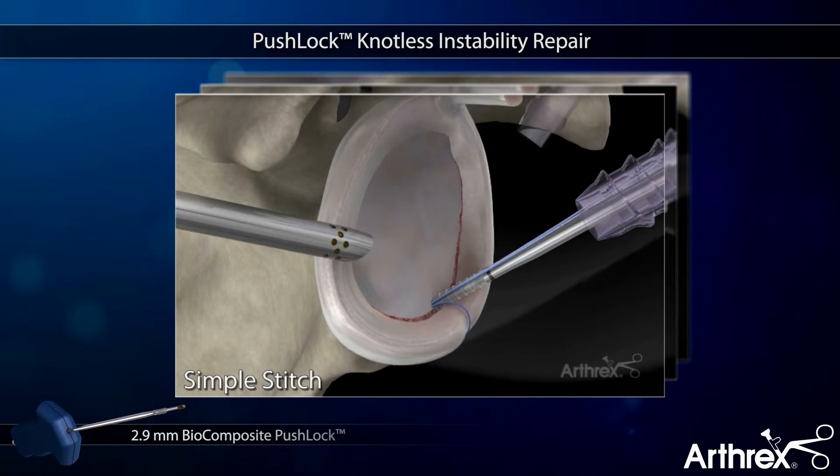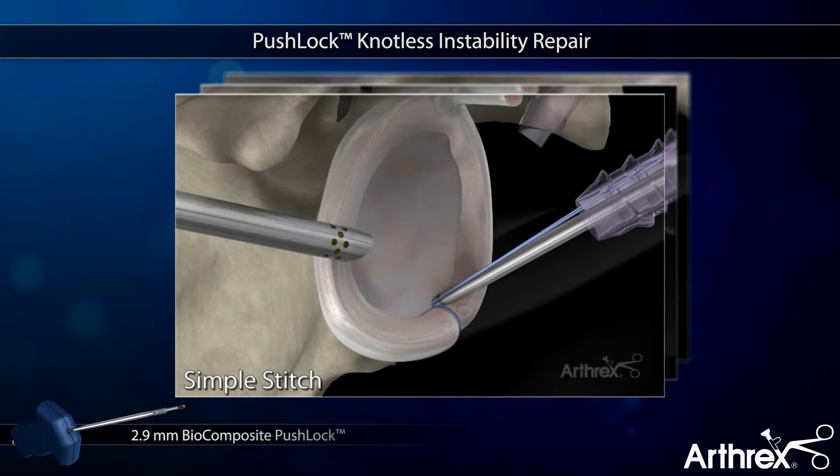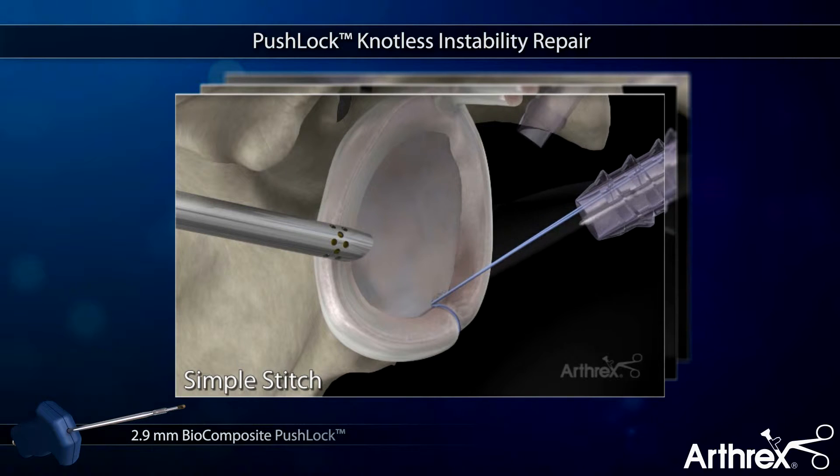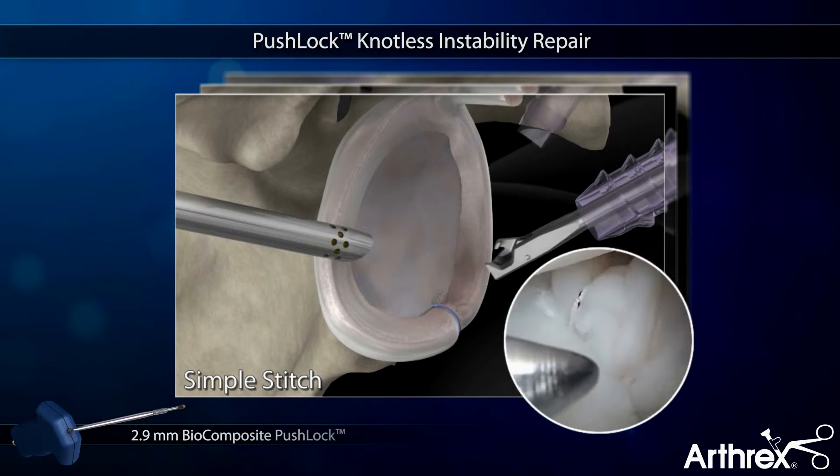The fiber wires are delivered into the bone socket. Tension is clearly visualized, adjusted, and then locked into position with the Push-Lock anchor body, creating a strong and low-profile construct without knots.